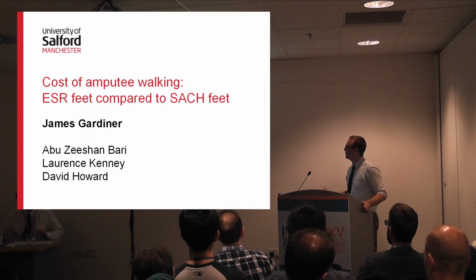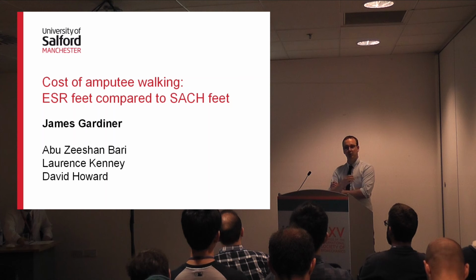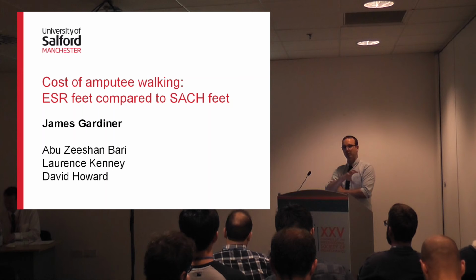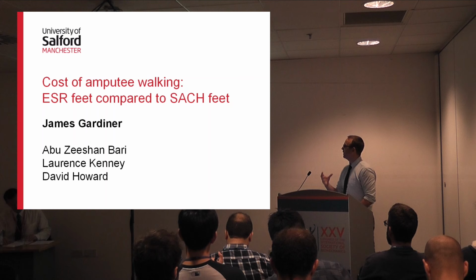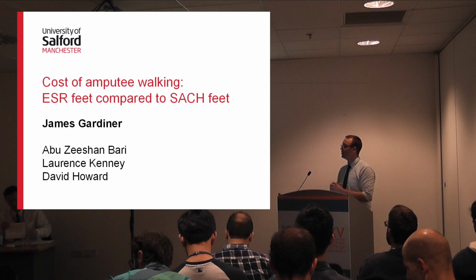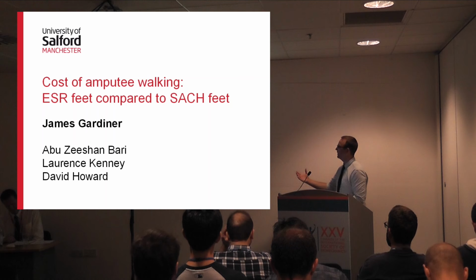So as Tony said, today I'm going to talk about the cost of amputee walking, and in particular I'm going to compare ESR feet with SACH feet. So ESR feet, for people that don't know, are your carbon fiber or glass fiber kind of blades that you see. You see them a lot in running in the Paralympics, but we're talking about the ones that are used for walking today, and we're going to compare the cost of walking with those feet against your very traditional, very basic SACH foot, which stands for solid ankle cushioned heel. So it's very rigid and then just has a bit of cushioning in the heel. And ESR feet stands for energy storage and return. So it's this idea that they somehow store some energy during stance and return it later on.